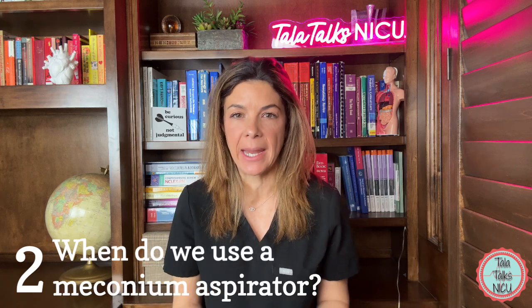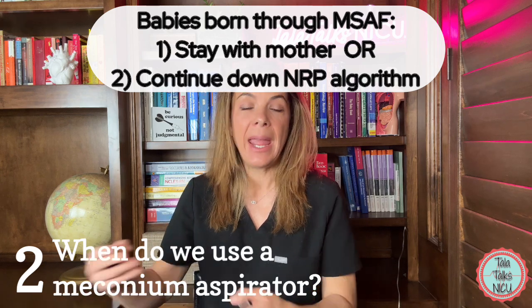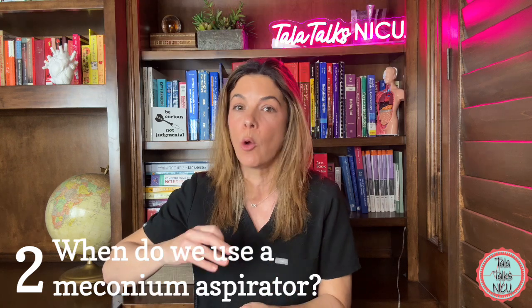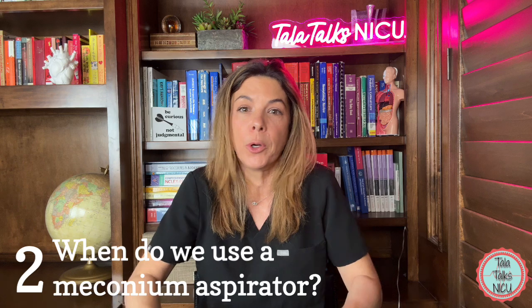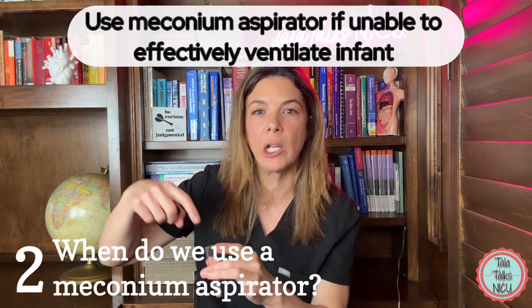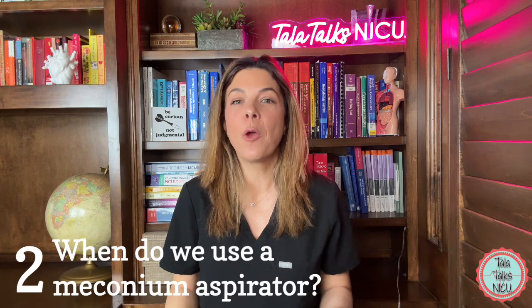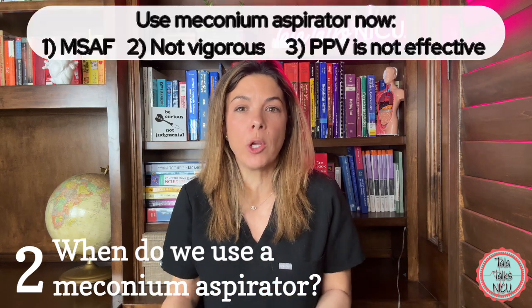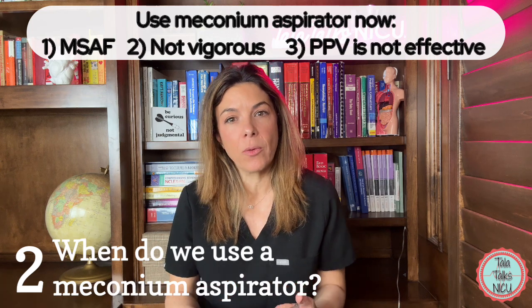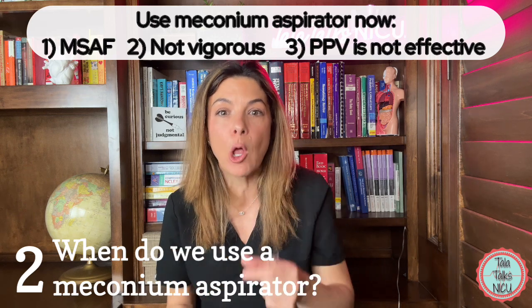Now, if a baby is born through meconium-stained amniotic fluid and the baby is breathing, term, and has good tone, that baby can still stay with its mother. If the baby doesn't have any one of those things, bring the baby to the radiant warmer and start the usual NRP steps as if born through non-meconium-stained fluid. Using the meconium aspirator would happen much further down the algorithm. So when do we actually use it according to NRP now? Three things need to be occurring: one, the baby is born through meconium-stained amniotic fluid; two, the baby is not vigorous or has very poor tone and very poor breathing; and three, the positive pressure ventilation you're giving is not effective — possibly because meconium is blocking the trachea.